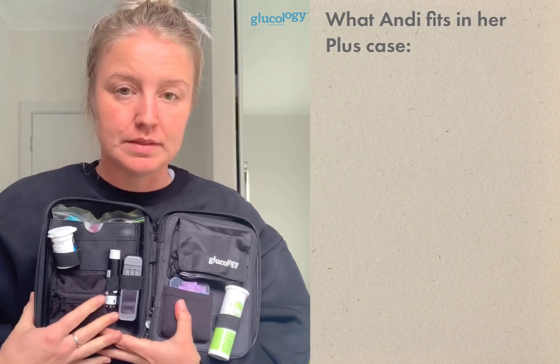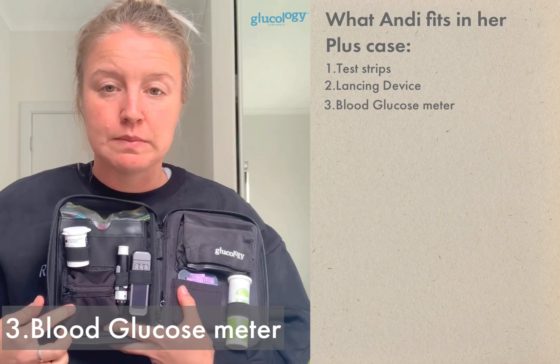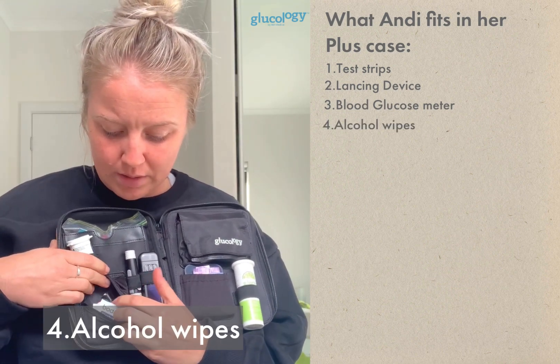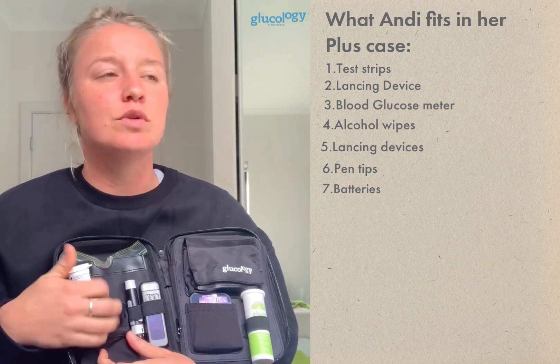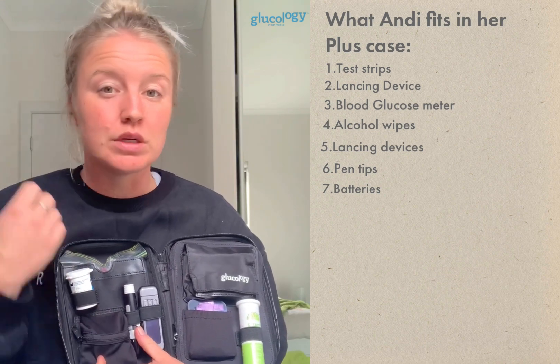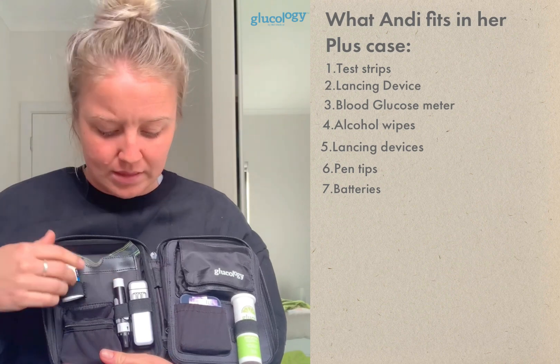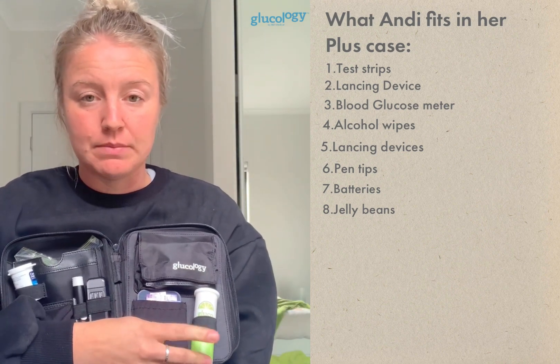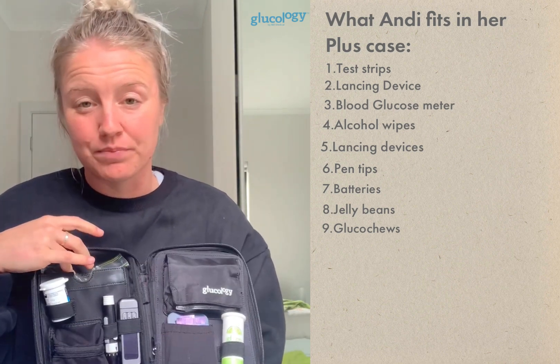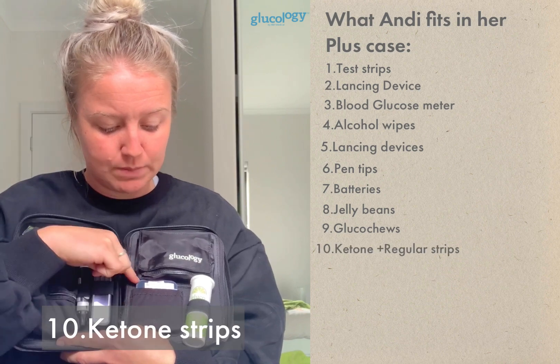When you open up the travel case plus, I've organized it with test strips, a lancing device, and a blood glucose meter. The zip pouch holds alcohol wipes, lancing devices, pen tips, and batteries — small things you don't want to get lost. I've also used it as a temporary sharps container. In the back pocket I keep a bag of jelly beans and my IBD Medical Gluco Chews, plus extra hypo treatments and ketone strips with a spare meter.